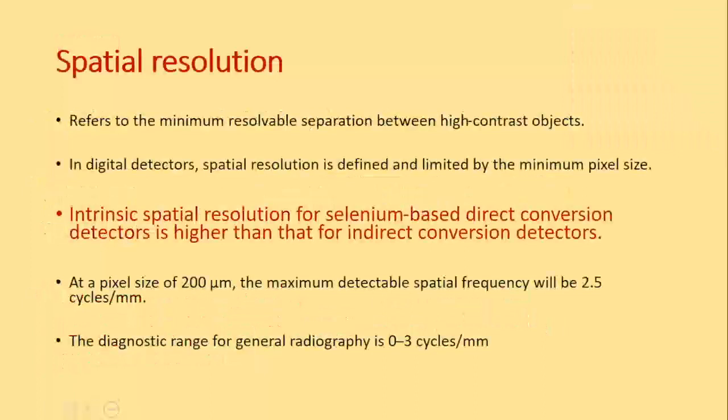Second, spatial resolution. By default, I told you, selenium by itself has great spatial resolution. So nothing to really pick and choose here. Most of the machines that come have great spatial resolution, because they use selenium.